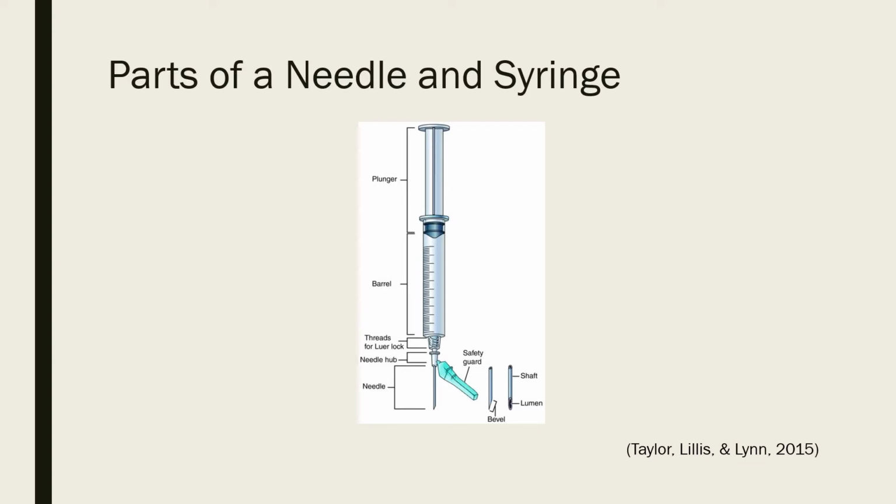And then you have the barrel of the syringe, and notice that there are markings on that barrel, and different size syringes have different markings. So we're going to let you look at syringes so that you can tell the difference between the two.